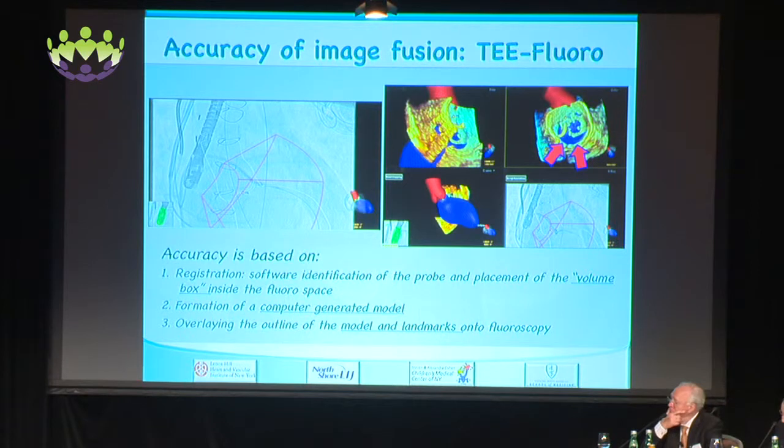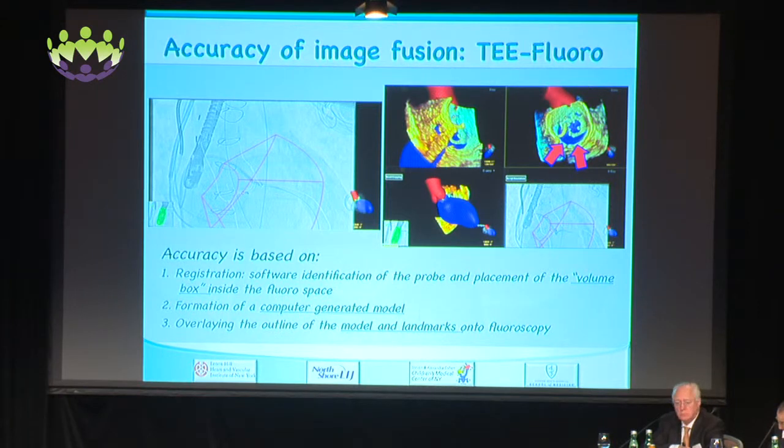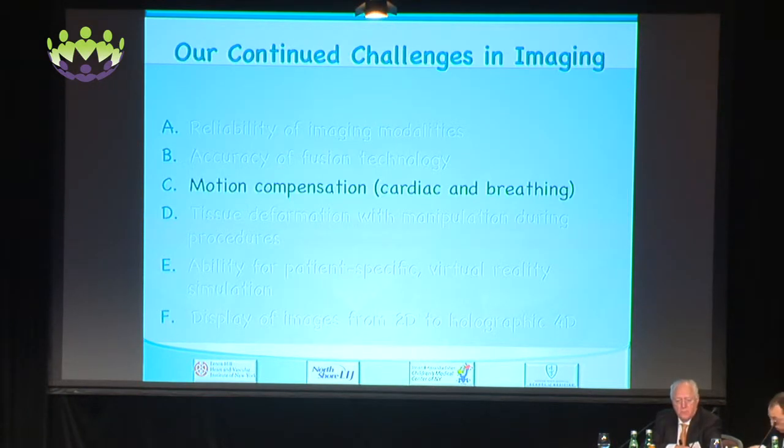The registration is constantly an ongoing registration with the probe of the echo. It depends on whether the fluoroscopy sees those dots of the transducer in a coaxial way to the X-ray, or if it's a little tilted. So the box that is generated by this computer can also be misleading. So all this needs to be improved, and I'm showing you that there are other problems.